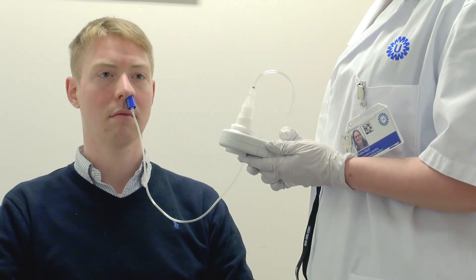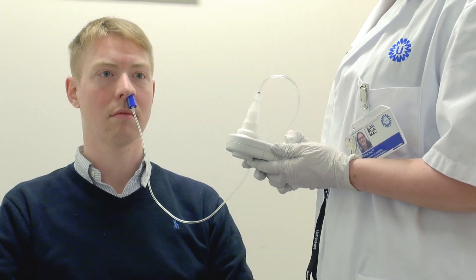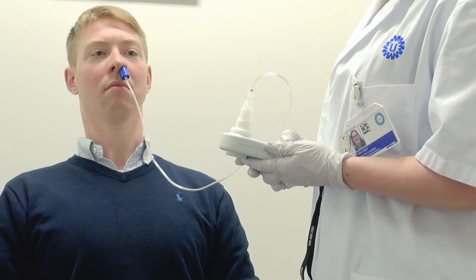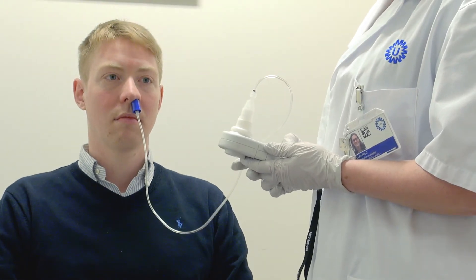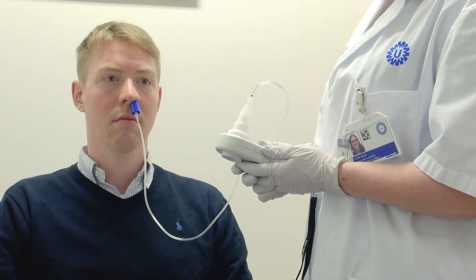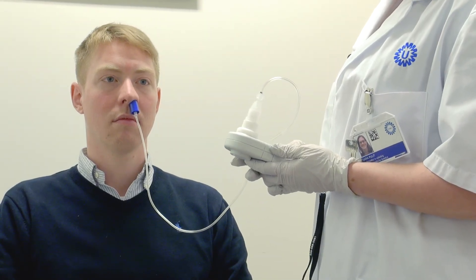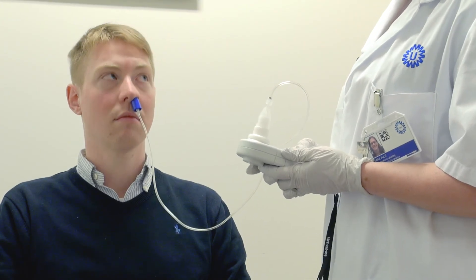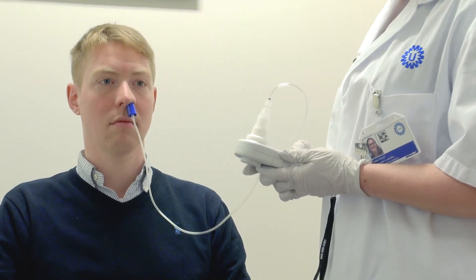Are you ready? On the count of three. One, two, three. Very good. I'm now going to shut off the device and turn it back on to SNP so that we can do one more test. When performing the SNIP test, you must wait at least 30 seconds between measurements.